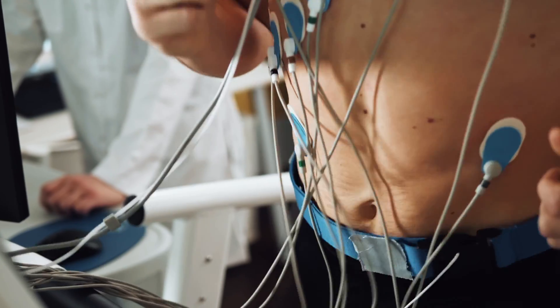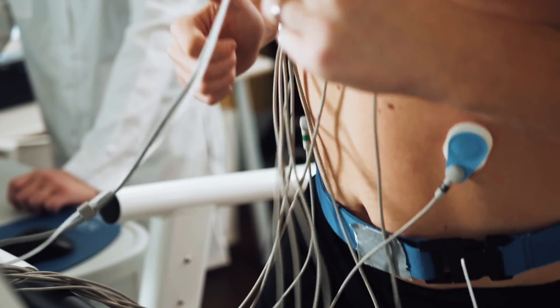There are alternative tests that your doctor may select, including stress tests, and we've had a video on what stress tests are. There is some radiation exposure with the CT scan, so we've got to be mindful of that, and also mindful about getting the heart rate as low as possible. If you do have an allergy to contrast or dye, then this is not the appropriate test for you. Although we can control most types of allergies nowadays, have a chat with your doctor about any alternative tests that may be relevant for you.